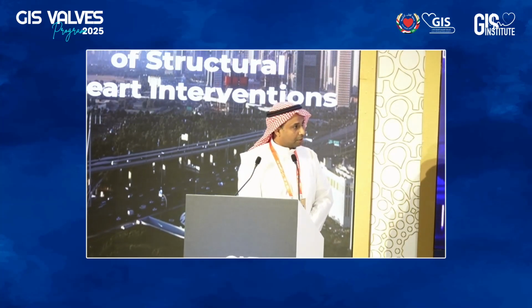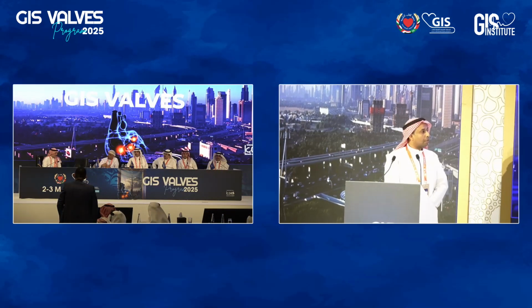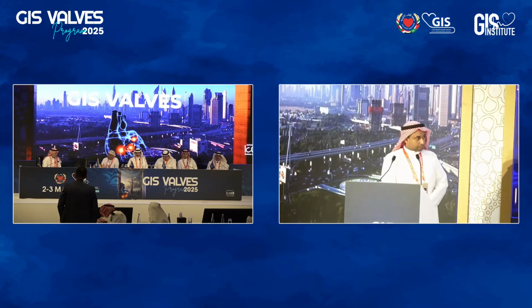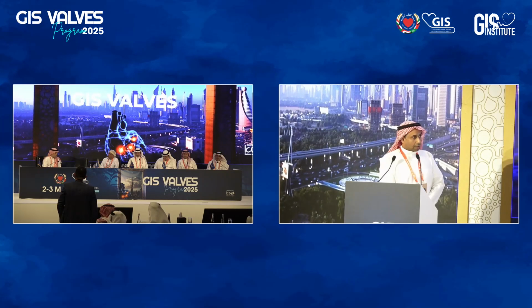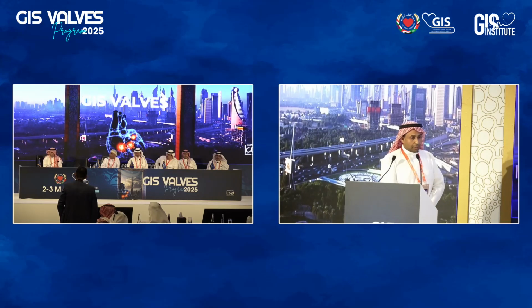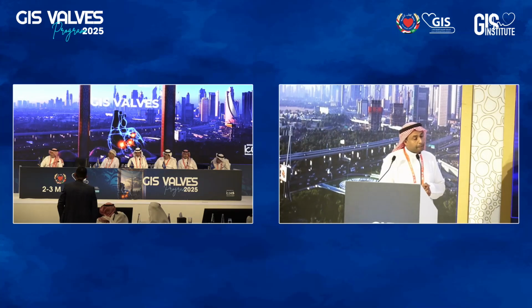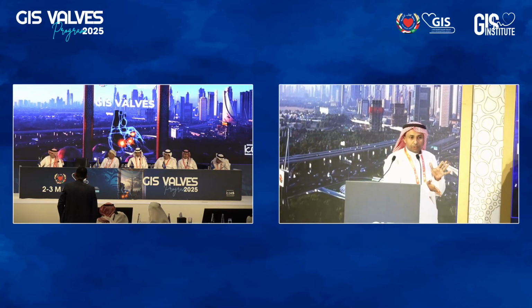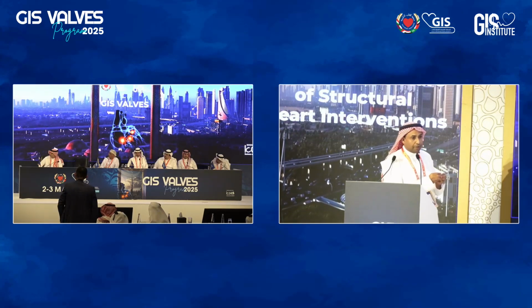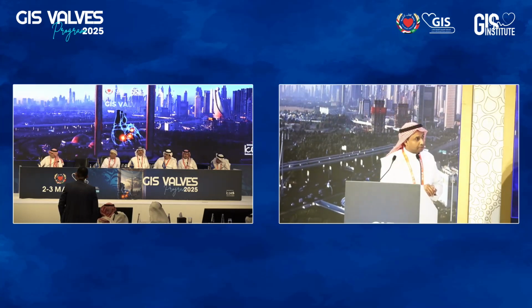Dr. Salem, just one question for Ahmed. Why did the surgeon intervene on the mitral? Because the mitral was mechanically affected by the low valve. The mitral was perfect before the implantation of the aortic valve. So I tried really hard with the echo guy, also the one who did the TEE, and I couldn't really appreciate anterior mitral valve perforation or disruption beside the restriction of the movement. But the surgeon, after all, found out that the leaflet is perforated. That's what he was telling us.